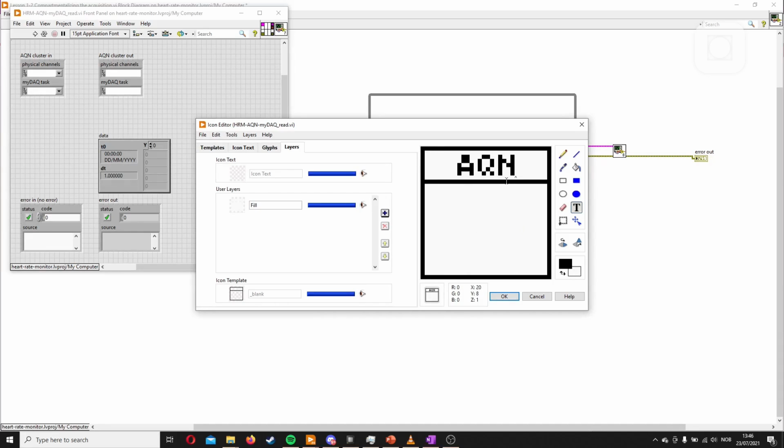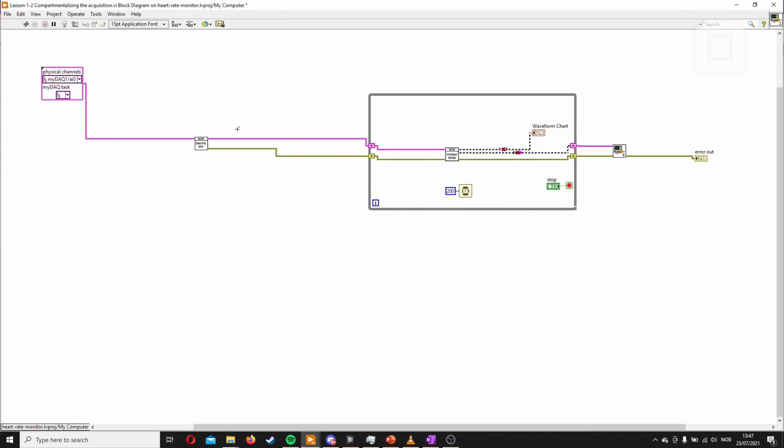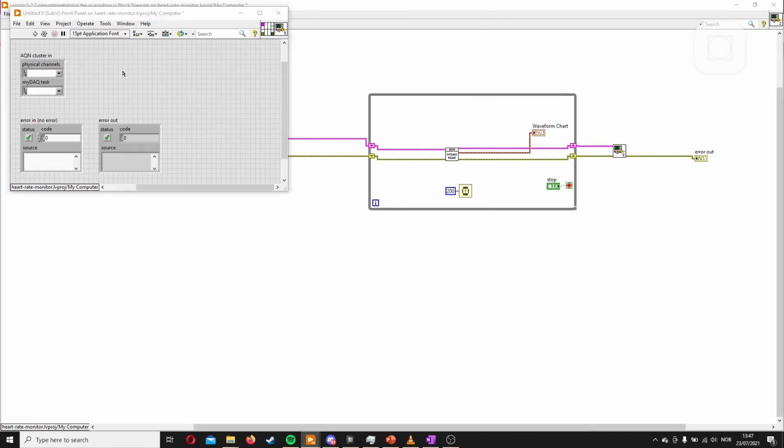It's just normal to have the bigger, broader perspective on the top and then the specifics on the bottom. And this is the myDAQ read. And we can move it a little bit with arrows to make it more centered. Press OK. Save. And here we see now there's an error, so we just need to swap these out. Swap. Yeah, we'll fix the bendy wires afterwards. There you go. And then lastly, it's the close.